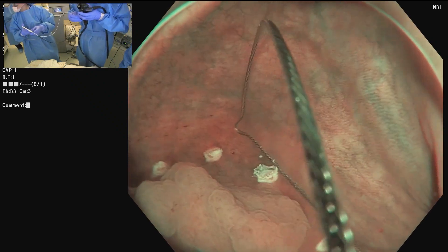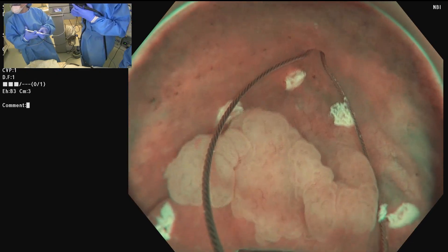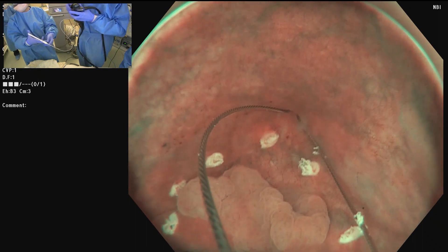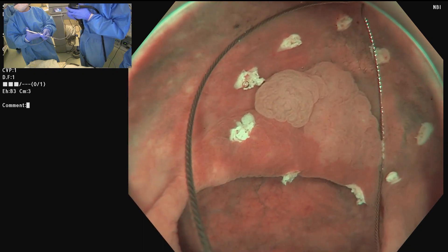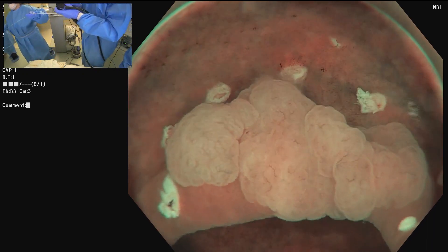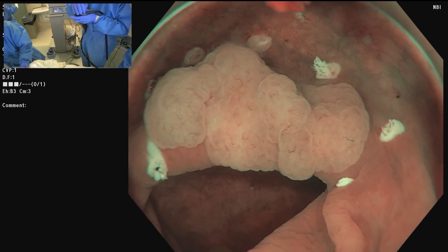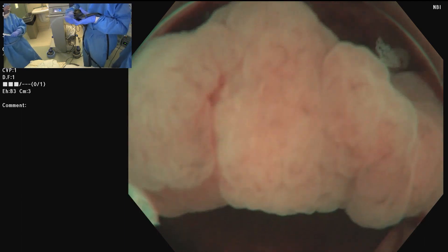I could use a smaller one. For safety, in the right colon doing hot snare with a 33 mm snare — no real concern, but a 25 mm would have worked as well. Let's do this the right way; give me a 25. I always make sure I get generous horizontal margins, and my resections now are nearly all en bloc — I'm able to achieve that.